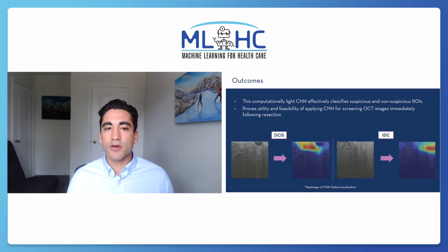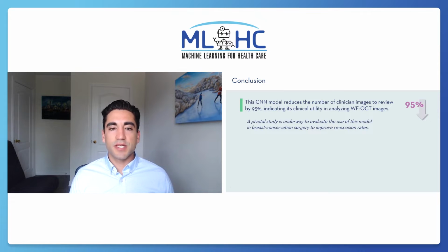This study, with a model tuned to real-world clinical application, demonstrated that it is feasible to accurately identify regions of suspicious DCIS or IDC in breast lumpectomy specimens to aid in improving surgical outcomes and reducing re-excision rates in breast conservation procedures. To conclude, this study utilized wide-field OCT images taken at a time of resection and applied a CNN model to reduce suspicious ROIs by 95% in a clinically relevant timeframe.